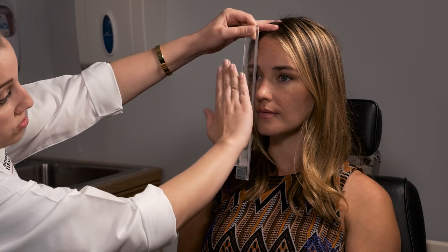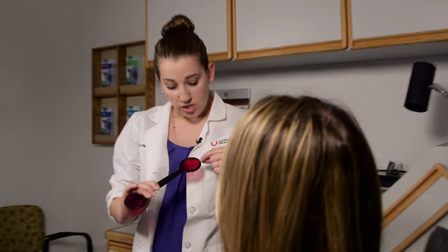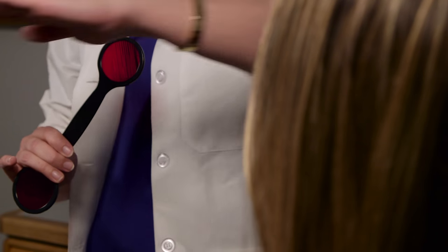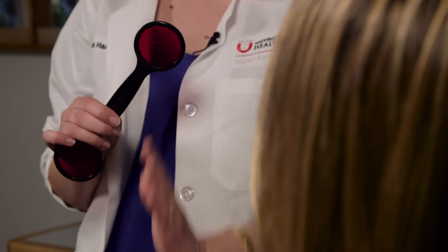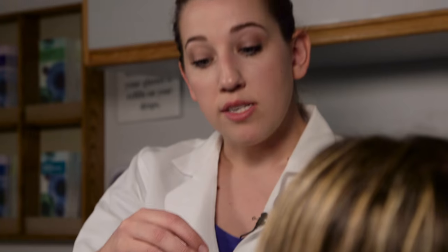For her, I'm actually inducing one because she's very well aligned. For the next test, we're going to do the Maddox rod. The Maddox rod is a series of cylinders. You can have the patient orient them vertically, which will give you a horizontal red line, or orient it horizontally, which gives a vertical red line. The idea is that you give the eyes two very dissimilar images so you can very precisely measure the deviation.